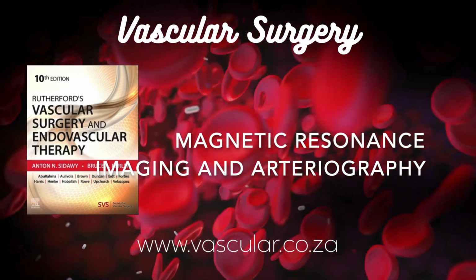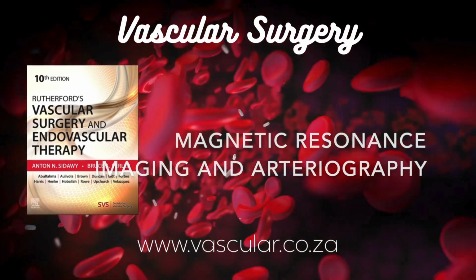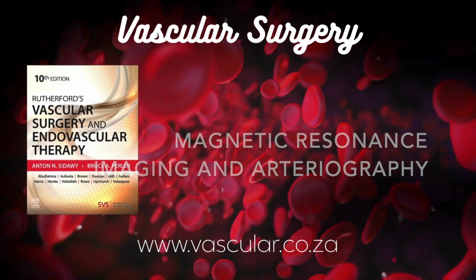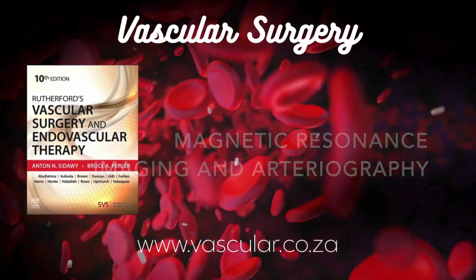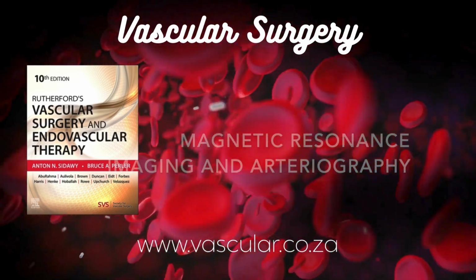All right, fantastic overview of the tech side. Now let's get into the clinical applications. Where does MRA really shine in day-to-day medicine? Let's start up top with the aorta. Okay, aortic vascular disease. Contrast-enhanced 3D MRA is a powerhouse here.